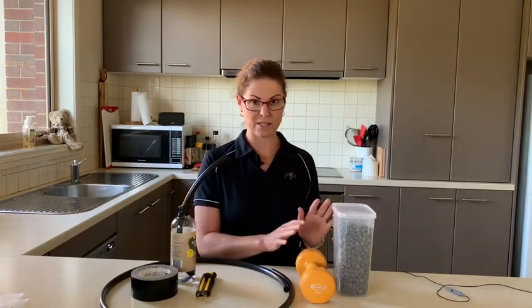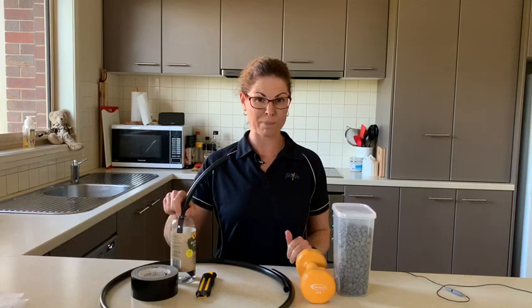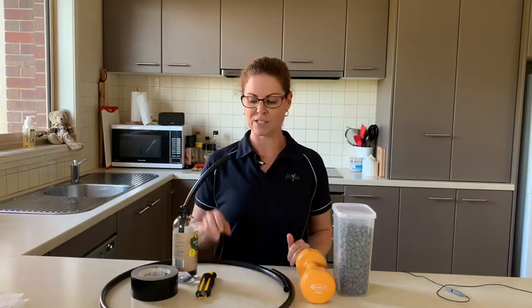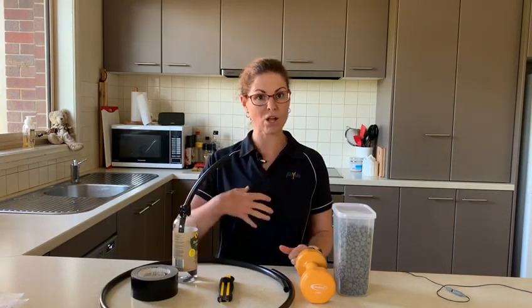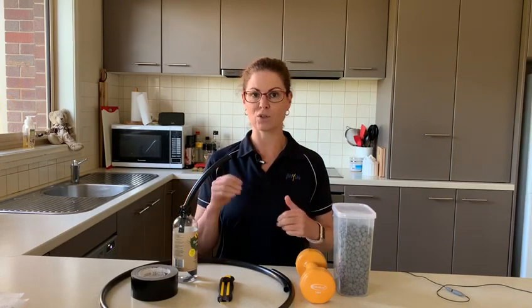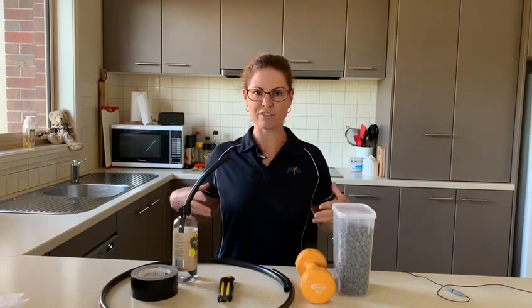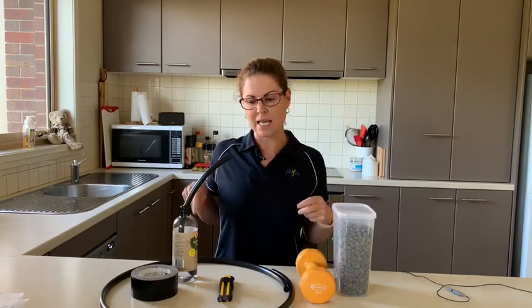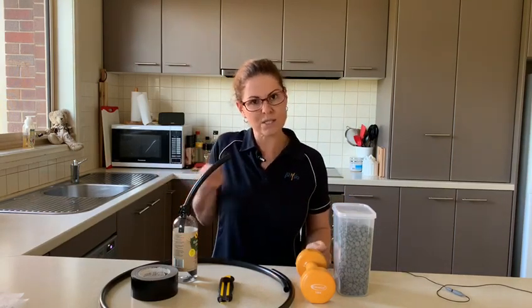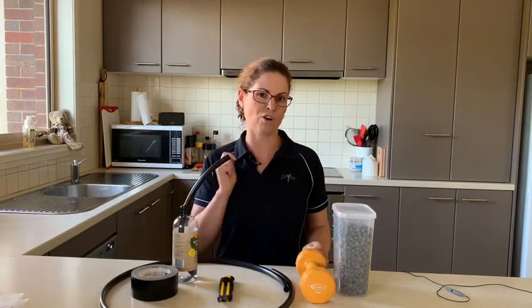So two things: bubble PEP, and we'll do some exercises for your lungs as well to get them nice and strong for your muscles around your chest. So what's bubble PEP and what's PEP? PEP is positive expiratory pressure. When we breathe in and breathe out, our upper airways often shut before our lower airways can fully empty, so we don't breathe all the air out of our lungs. If you can keep the upper airways open with some positive pressure, you'll empty more air out and get more air in. It also helps move the gunk around the bottom of your lungs — your phlegm and sputum. If you've got any plugs sitting in the outer reaches, you can get some air bubbles behind that, and it can force the sputum plugs up to your upper airways where you hear them rattling and feel them, and that's when you cough them out.